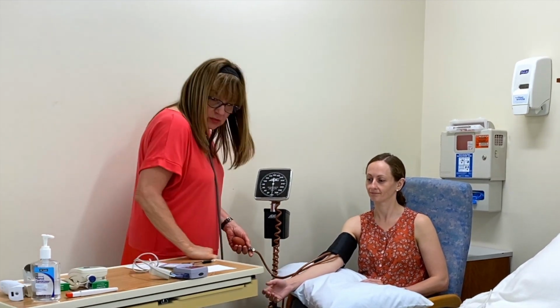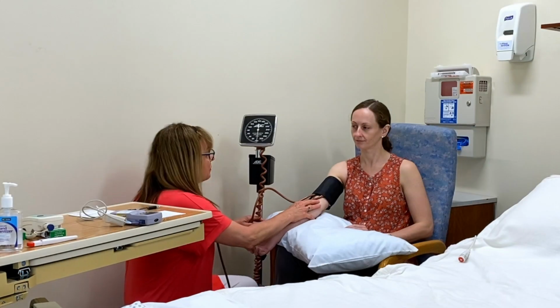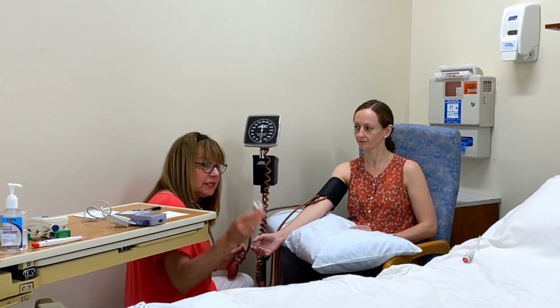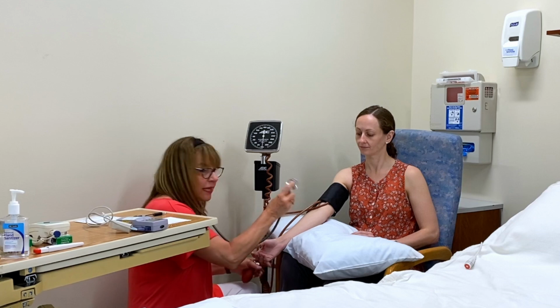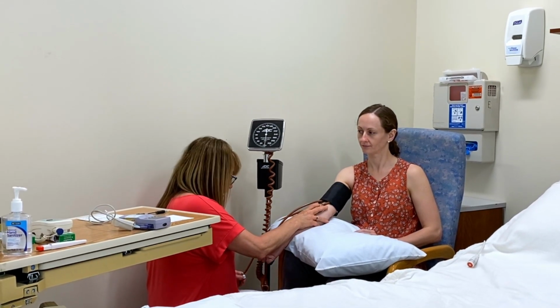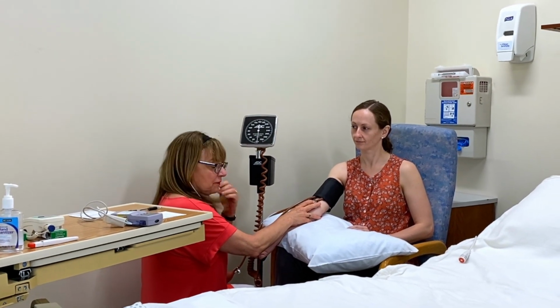Okay? So what I'm going to do now is palpate her brachial artery. I'm going to take my stethoscope, which amplifies sound, and place it over her brachial artery. Then I'm going to inflate the cuff.